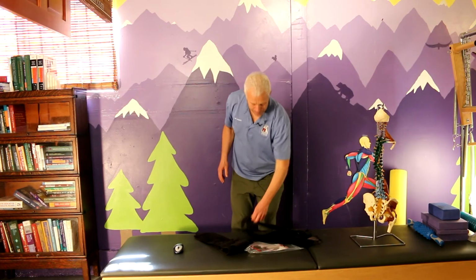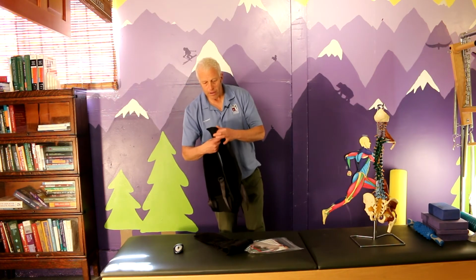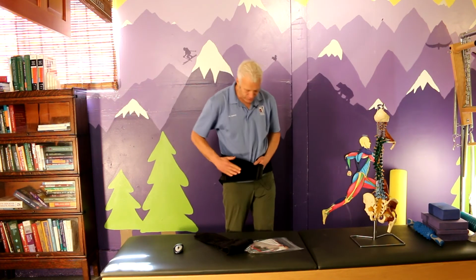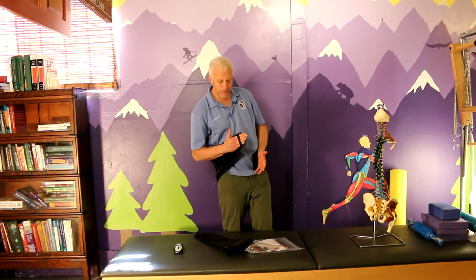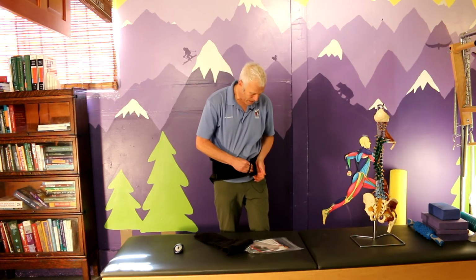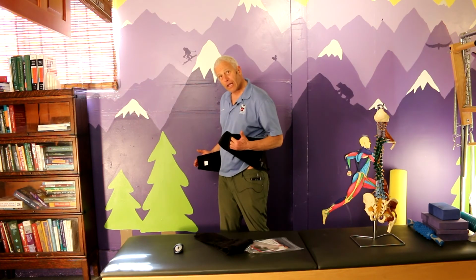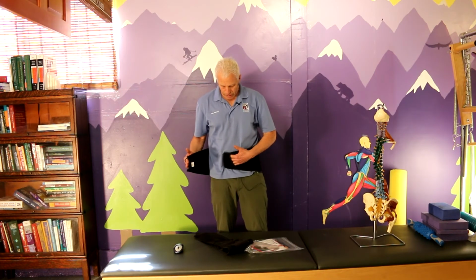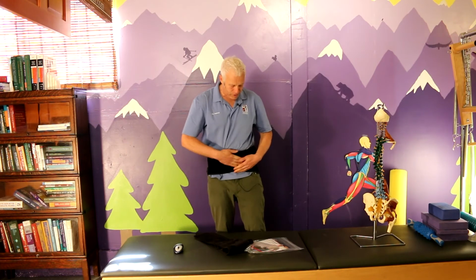So let's put it on. Like I said, you're going to want to have it so that the label is upright. And then you see here, the right hand has this nice little loop that your fingers can fit in. And then the left hand has a pocket here that it fits in. What that gives you the ability to do is put the left hand down and then wrap the right hand around and get a really nice snug initial fit.